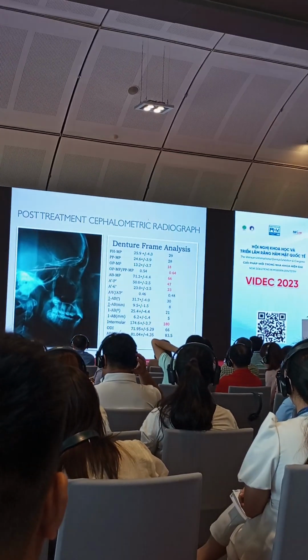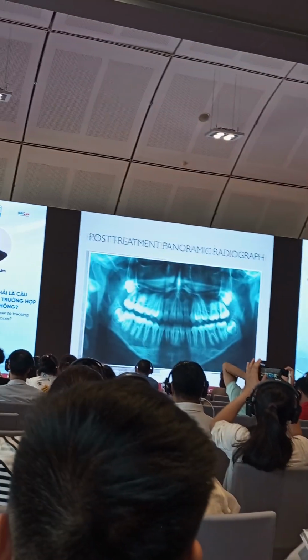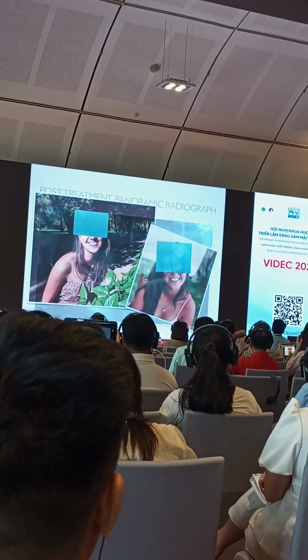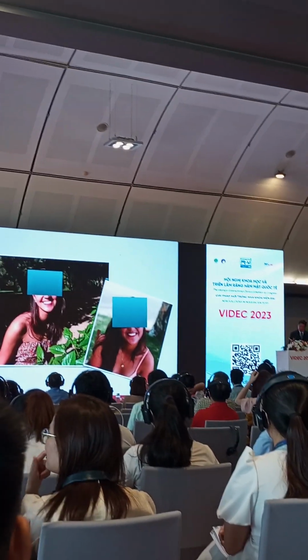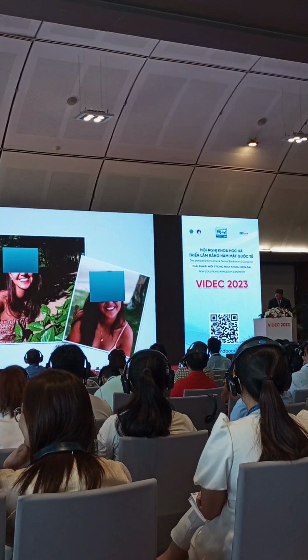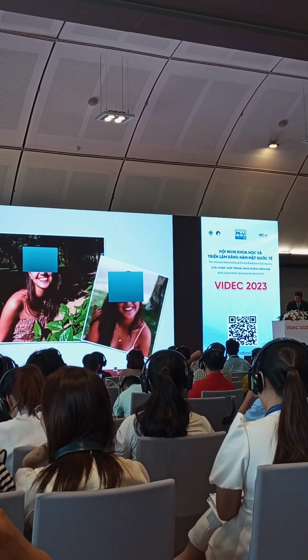This is the cephalometric radiograph, and then this is the panoramic. The third molars are still there. So then, I searched her again on Facebook, she's now there. The bite is still normal, good bite. So I don't have any problem with her bite yet.